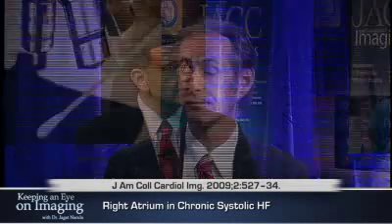And you have a study in JACC Imaging on the importance of right atrial volume in predicting prognosis in patients with heart failure. Why do you think that would be important? Well, first of all, Bill, it's a pleasure being here. The left atrial volume index has been thought to be the hemoglobin A1C of people with diastolic heart failure. So we looked at the right side of the heart as a marker of RV function. The worse the RV, the worse the prognosis. The right atrium is a very simple measure of the dilatation of the right atrium, and it could be a very good predictor. So what did you find in that study that you did?